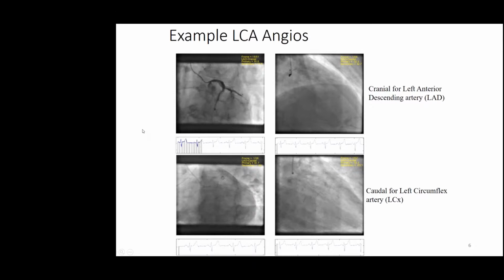of, what you can see there is a catheter through which they are injecting the contrast agent, and it's filling the vessels gradually. Now, of course, this is made more difficult to understand by the fact that in this case, the patients are breathing normally. So you can see the respiration, and also, of course, the heart is beating.